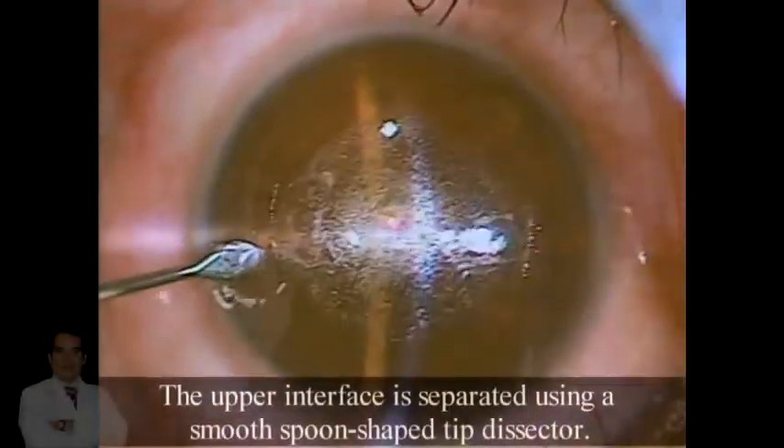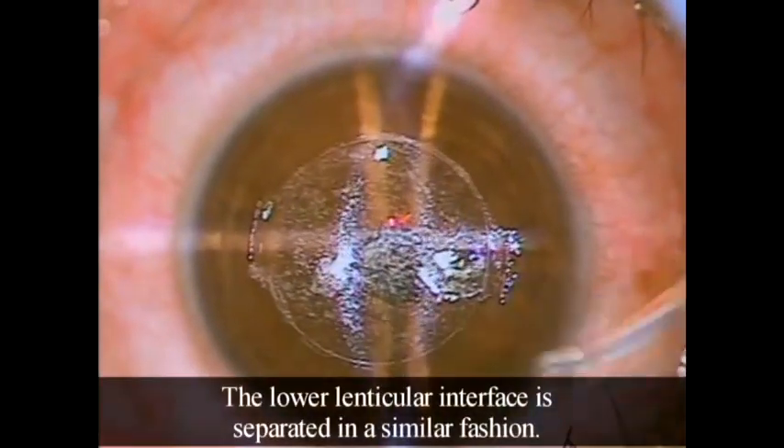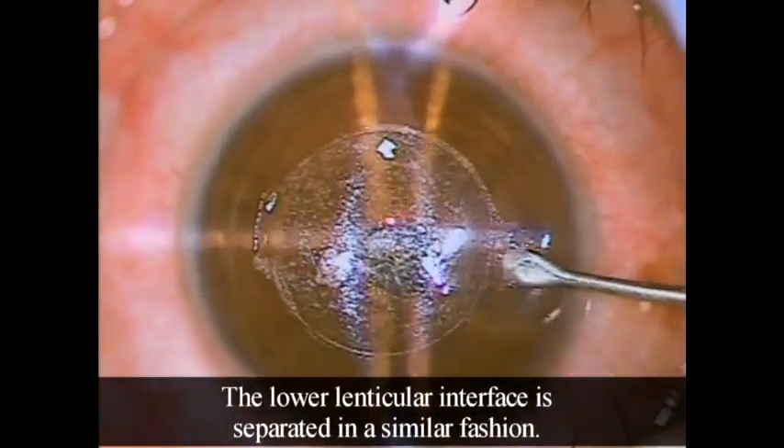The upper interface is separated using a smooth spoon-shaped tip dissector. The lower lenticular interface is separated in a similar fashion.